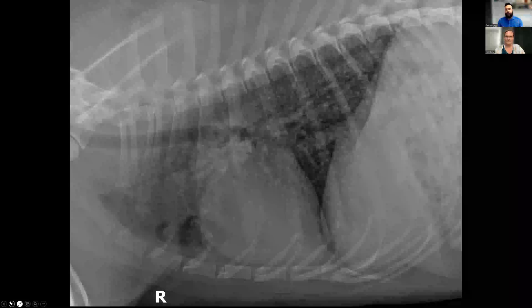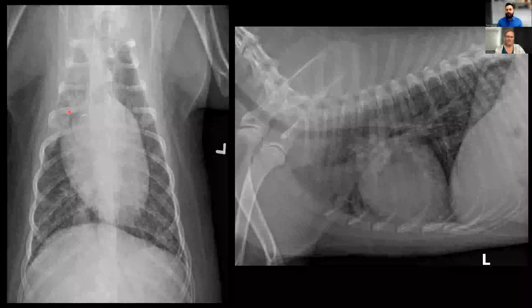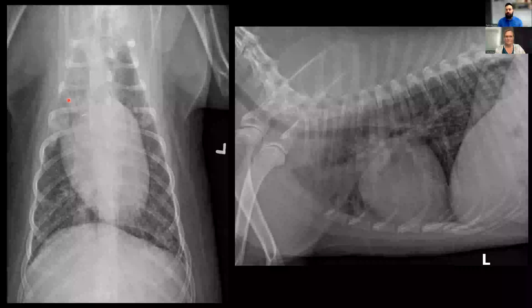When we're looking at our thorax, it's always important to take a systematic approach and look at everything. I really want to focus in on the lungs, because that's where the problem is and what we'll be looking at from a cytology perspective as well. The largest increase in opacity is in the right cranial thorax, where we have a uniform soft tissue opacity with an air bronchogram — this is evidence of an alveolar pattern, the hallmark being increased soft tissue opacity, obscured vessel margins, and air bronchograms.